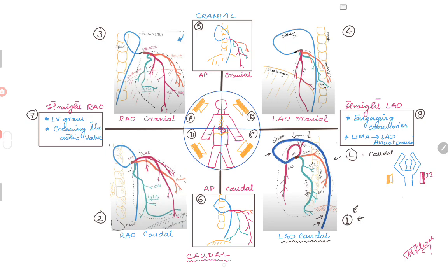This view is good for looking at the left main, the ostium of the left main, and the bifurcation or trifurcation of the left main into LAD, ramus, and left circumflex. You can really see the ostium of LAD, left circumflex, and in this case the ramus intermedius. You can also see the proximal segments of the great arteries, mostly the LAD and the left circumflex.